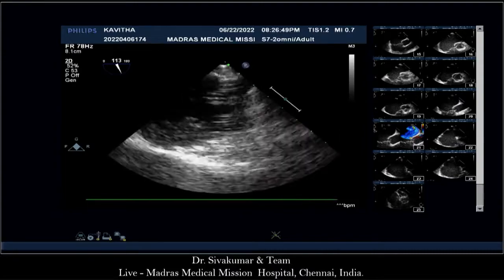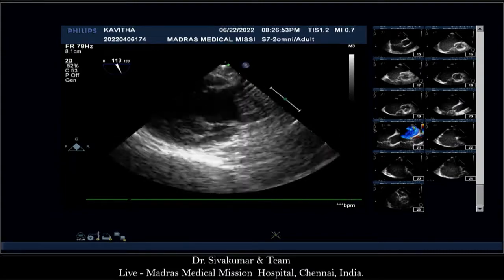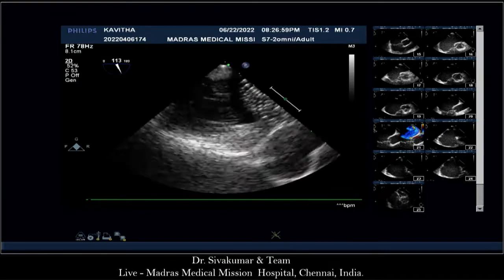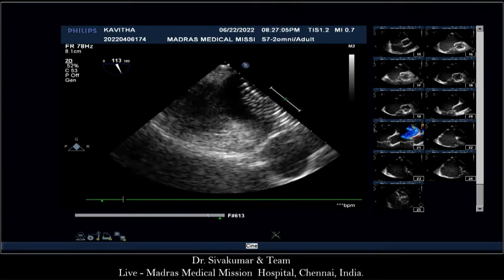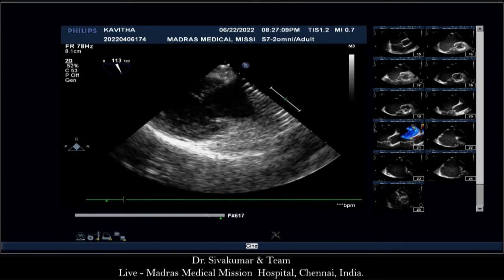Thanks, Stephen. This is the mitral annulus. And my device is slightly. That's a very good view because you do see the reverse of what we would see with the 4-chamber view. We got the whole of the disc just above. And if you plane it through as you're doing, we'll see how far back it goes. It looks like it's not going to touch. This is the posterior mitral leaflet and the anterior mitral leaflet.